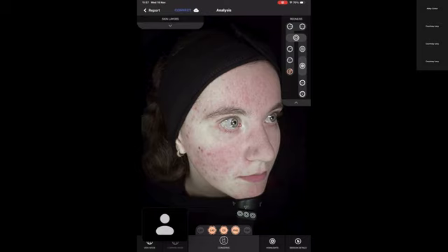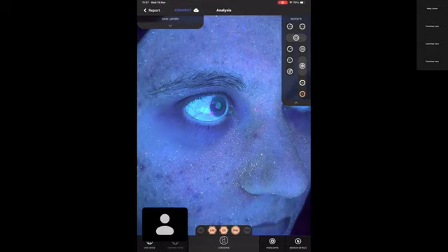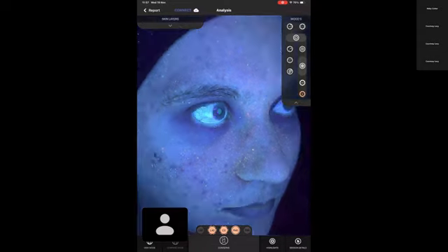The other one I want to show you is the Woods. So I mentioned Woods being great for acne. You can see she has lit up like a Christmas tree, and I'm zooming in here to show the yellow dots being the lipid sebaceous glands, very, very oily. And then we have the orange dots, which are the P. acnes bacteria. So all very, very active here.